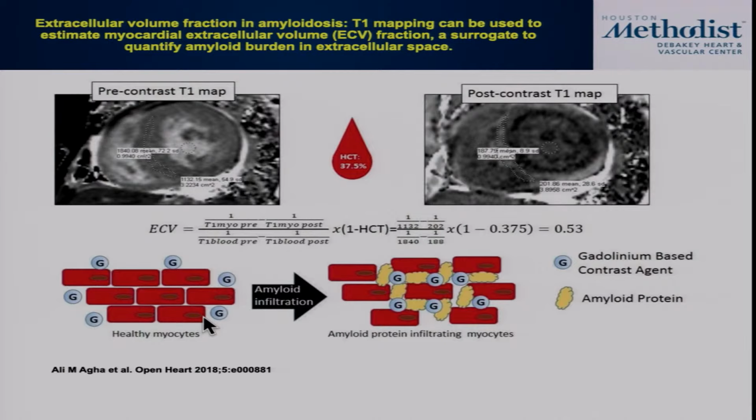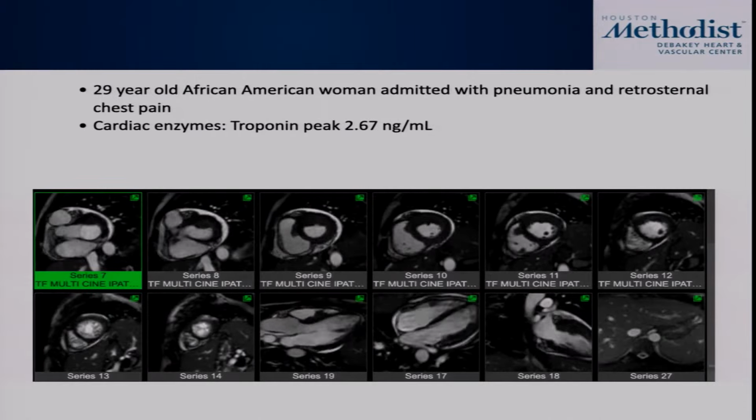It can occur in acute non-ischemic injury, like acute sarcoid, where again, you've got now myocyte necrosis, and you've got edema and inflammation in that region. And it can also occur in conditions like amyloidosis or infiltrative cardiomyopathy, where you have protein deposition between the myocytes. In all of these scenarios, you can see it leads to an expansion of the space between myocytes, and that's where the gadolinium goes. Gadolinium goes to the extracellular space, and as a result, there's increased gadolinium, and therefore you see hyperenhancement.